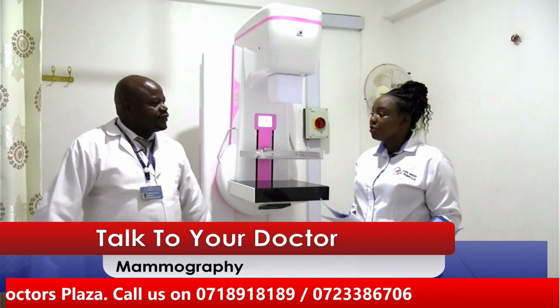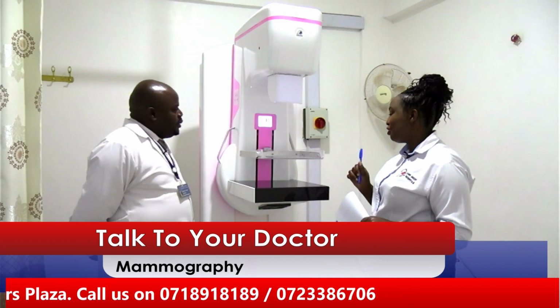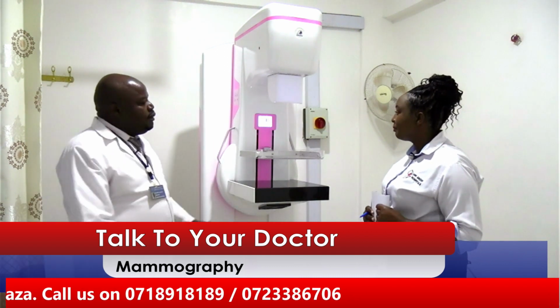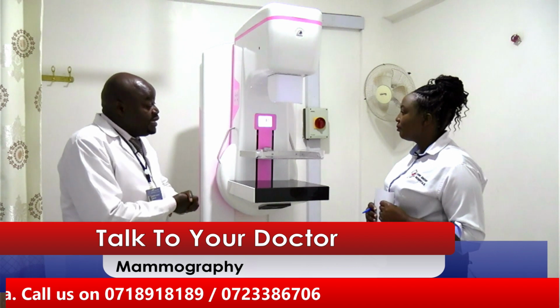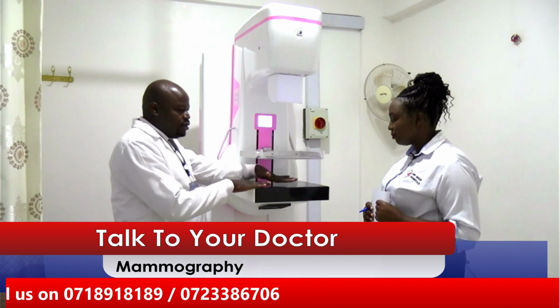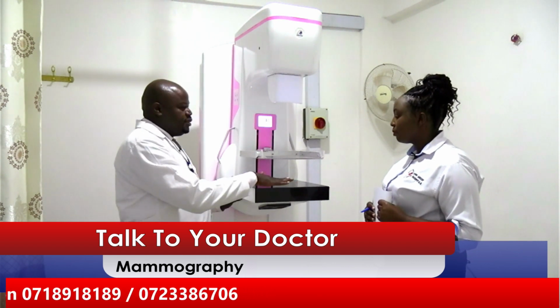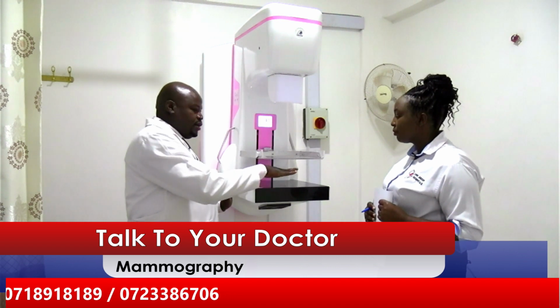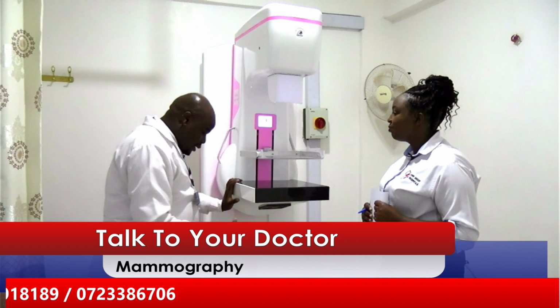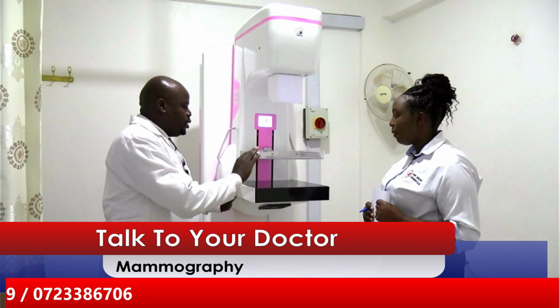Yes. So now I can see the mammogram machine. So how is the procedure performed? Now this is the machine. This is the mammogram machine. Usually the patient stands in front of the machine. Then the patient places the breast on top of this plate. Once the patient positions the breast here, then the radiographer, like me now, we use these other plastic plates to compress the breast.